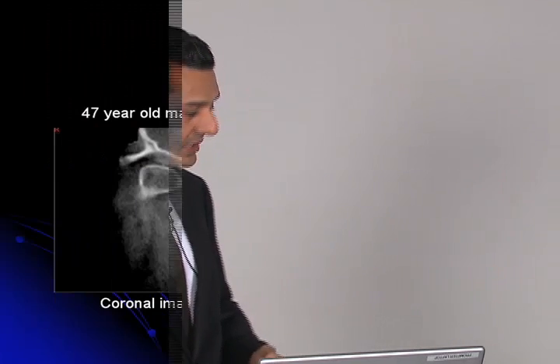And since a lot of times we see these in images and sometimes we see them incidentally in implant digital treatment planning images that we see, because this is an older population, many of them that are getting implants are getting these kinds of reconstructive procedures. And it's not unusual to see osteoarthritis or degenerative joint diseases. So the orofacial pain and TMJ clinicians are using this more and more in open and closed mouth positions.